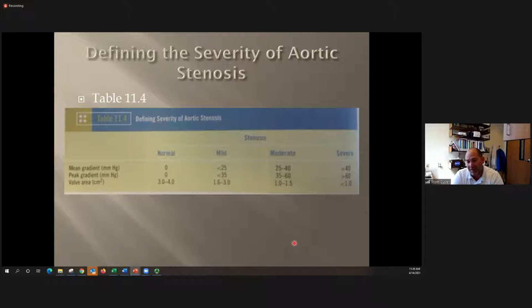Yeah, just noodle that for a while. I think it just takes some time, go through that formula, but when we're measuring the aortic valve area, what we're interested in is when the valve is fully open, how big is the hole? Okay, just like when we start looking at regurgitation, the thing we're looking for there is when the valve is closed, how big is the residual hole that's allowing the leak? It's the hole size that we're interested in.